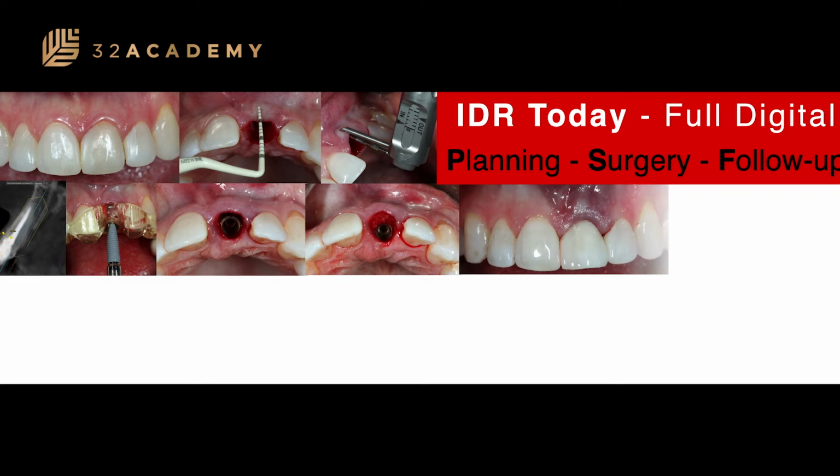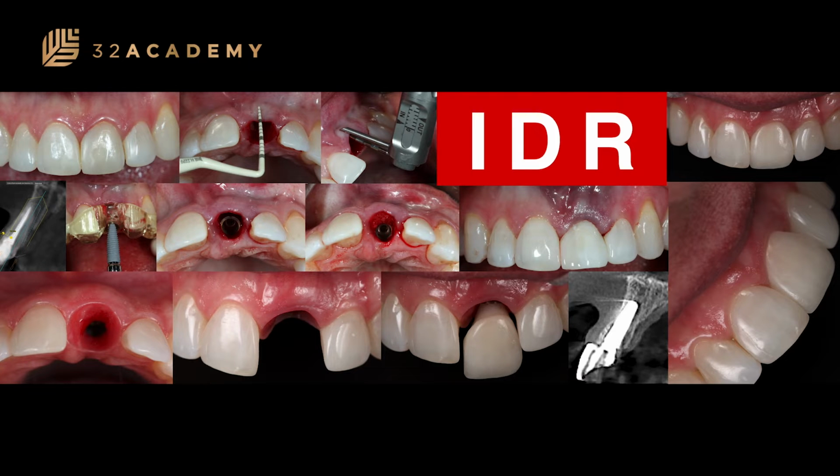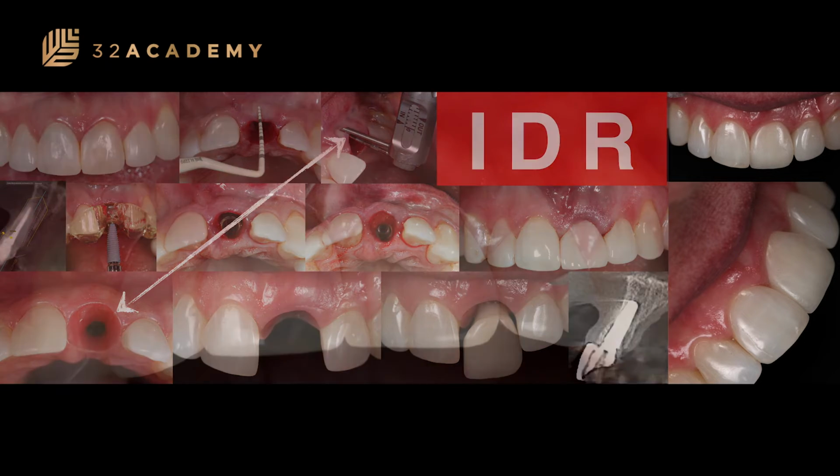We did the digital planning to insert my implant in the correct dimensional position. I used guided surgery. The bone reconstruction was performed here using bone from the maxillary tuberosity, and we immediately installed my milled provisional restoration. And after 3 months, we have a relevant change in the soft tissue quality and thickness without any connective tissue graft.